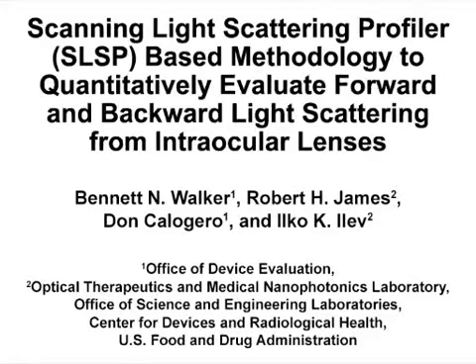The overall goal of this scanning light scattering profiler is to quantitatively evaluate the intensity and directionality of scattered light as it passes through an intraocular lens.